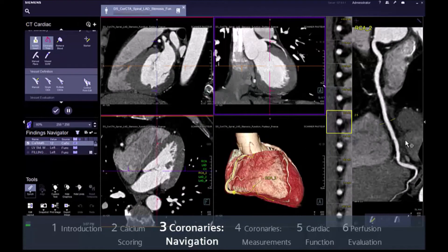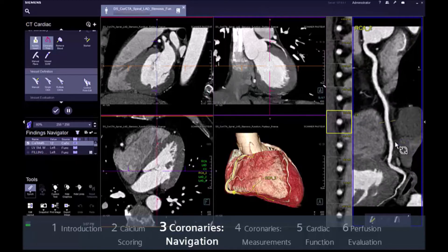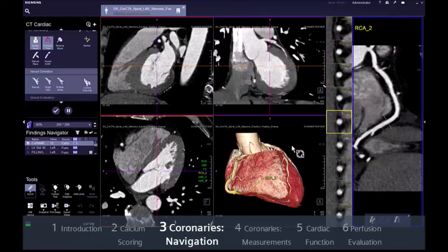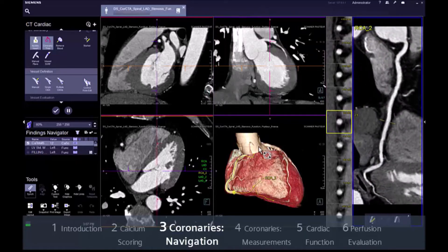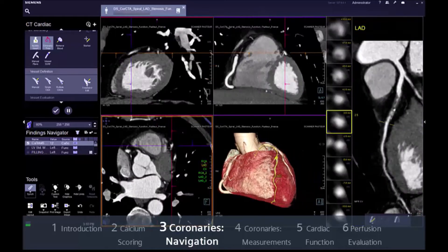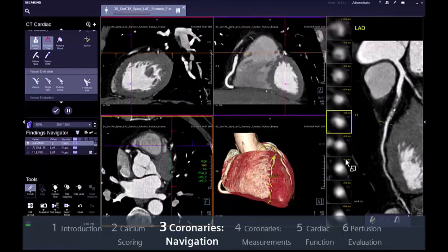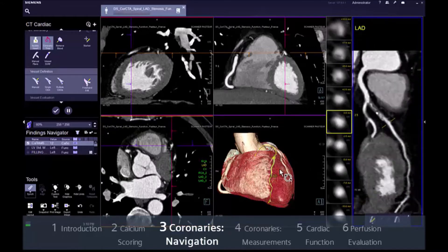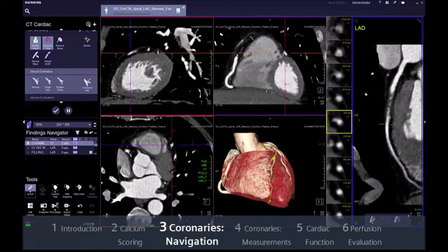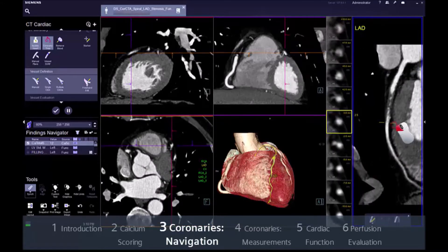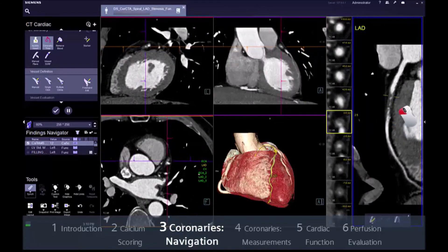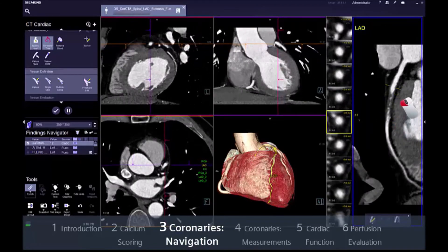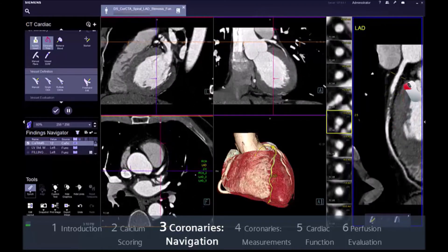The coronary arteries and grafts which have been automatically detected are labelled and displayed as a CPR on the corresponding segments, thereby speeding up your evaluation. This view can be very helpful because it provides an overview of the rotation around the axis, or drag the yellow reference over the vessel to navigate along the vessel.